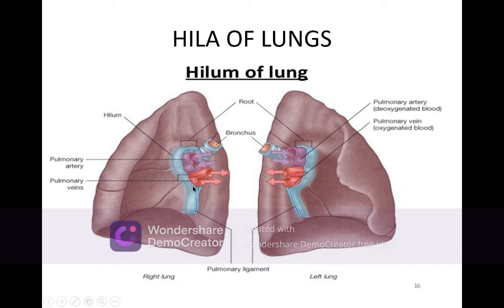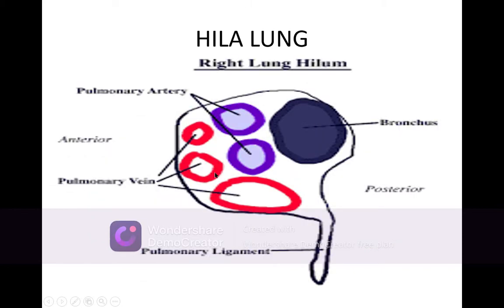The main one is the pulmonary arteries. Pulmonary artery and pulmonary veins both cause the bronchovascular markings, specifically arising from the hilum, and they are draining or supplying it. The hila are formed because of the vessels. These are the contents of the hilum, which I have described: the bronchus, the pulmonary artery, the pulmonary veins, lymphatics, and so on.